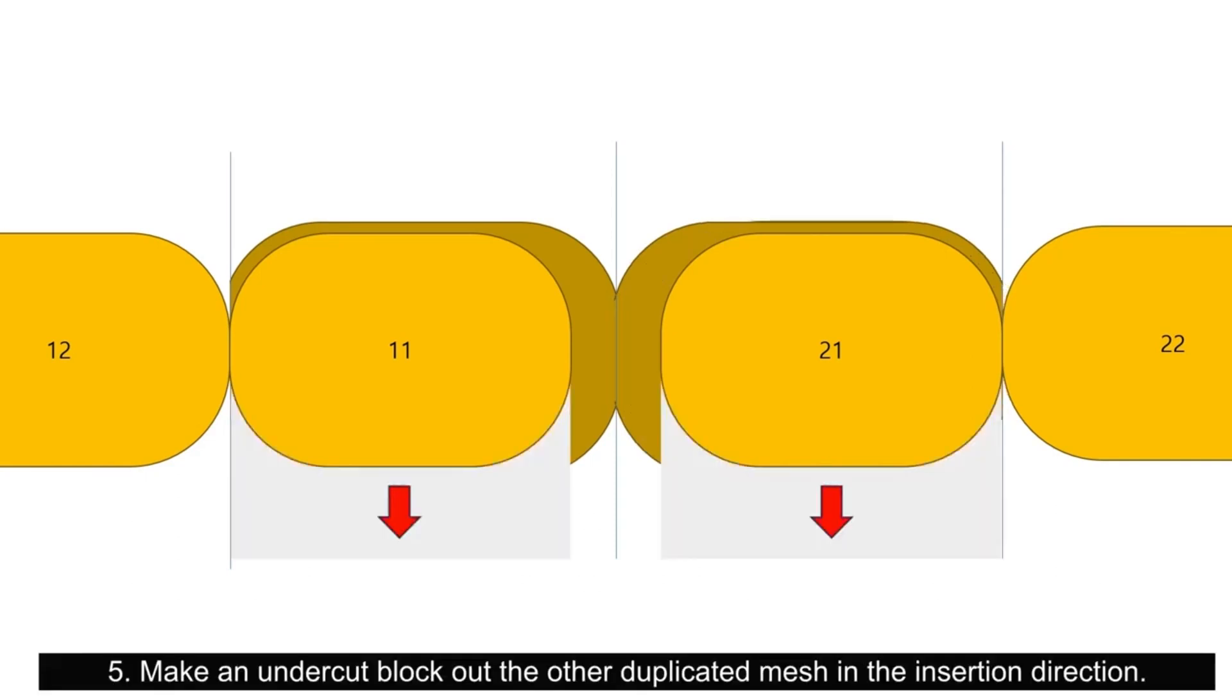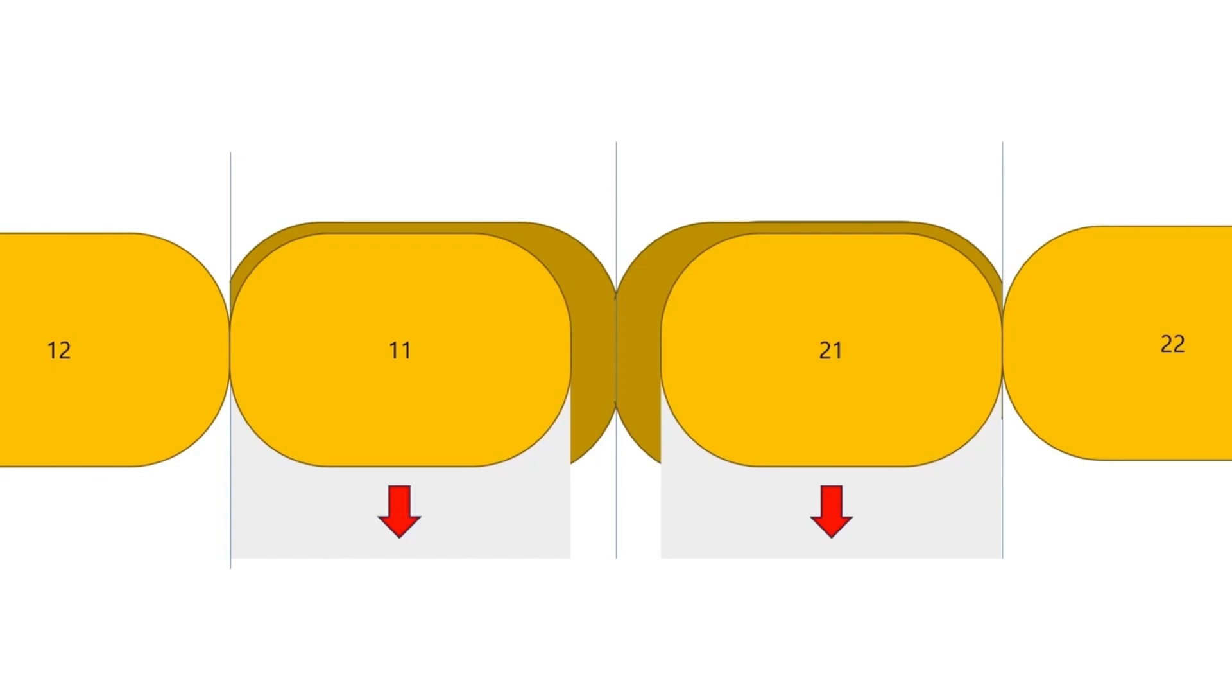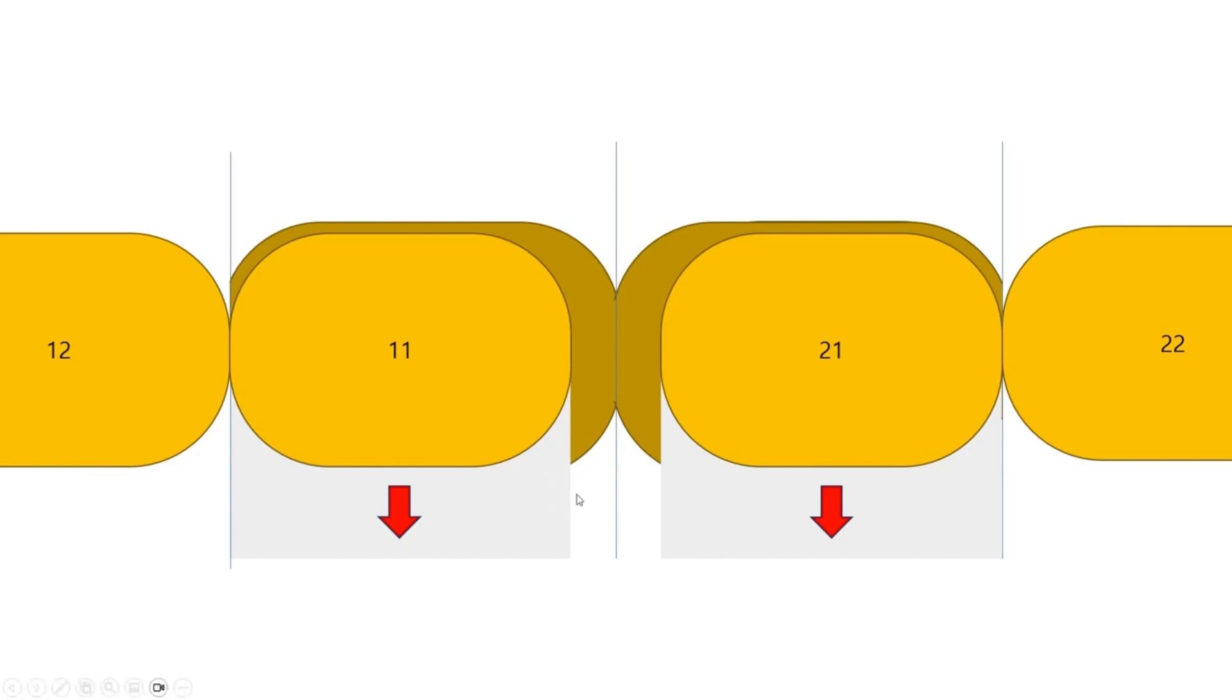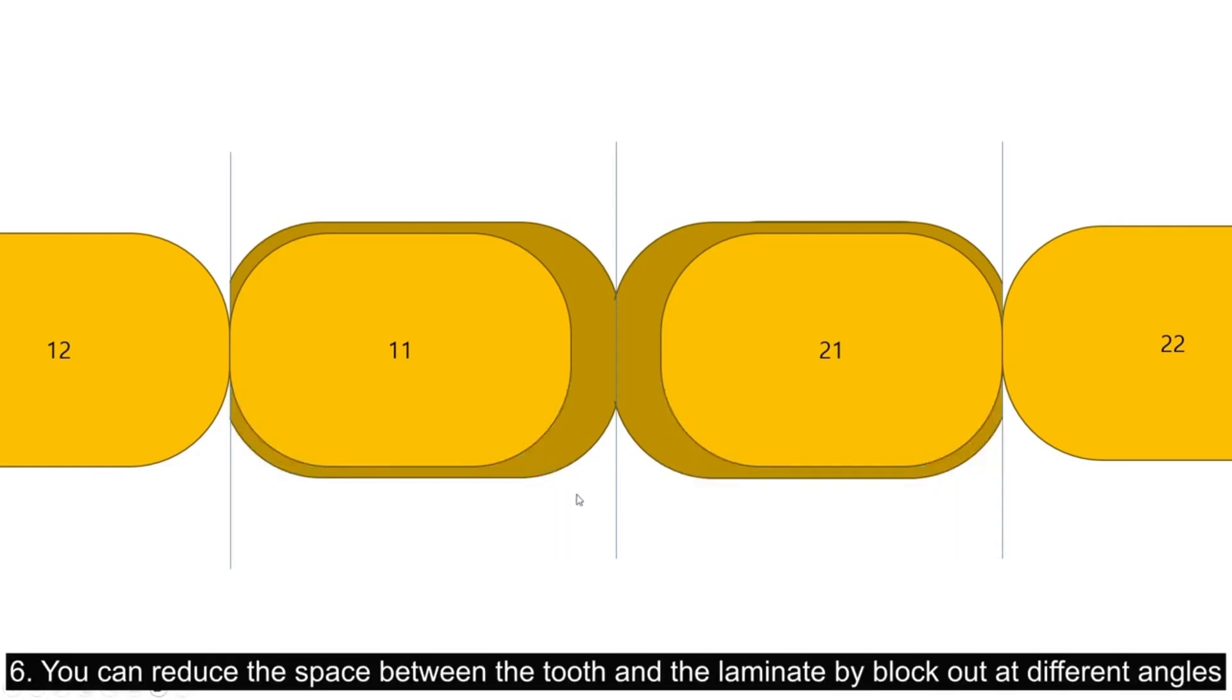Make an undercut block out the other duplicated mesh in the insertion direction. Depending on the direction of the block out, there may be a large space between the laminate and the tooth from the lingual side. You can reduce the space between the tooth and the laminate by blocking out at different angles.